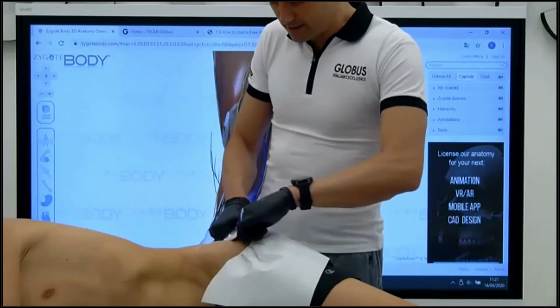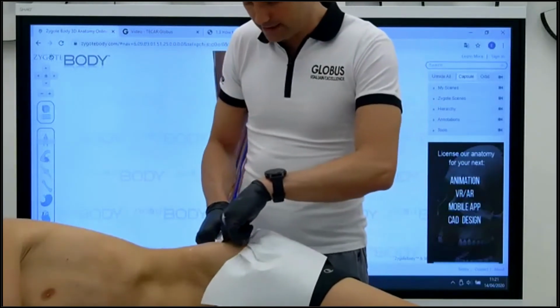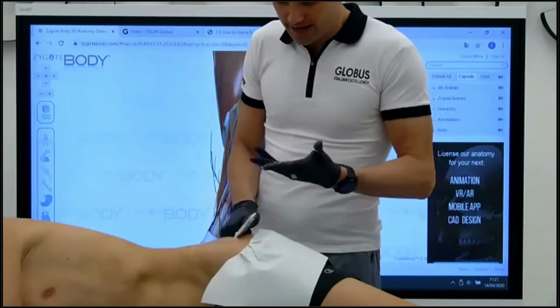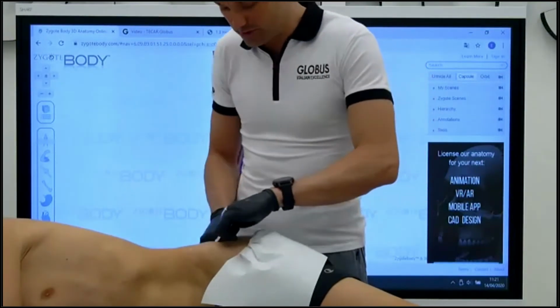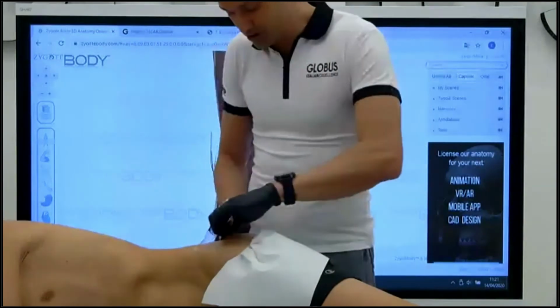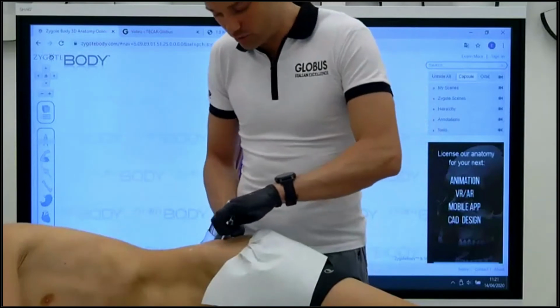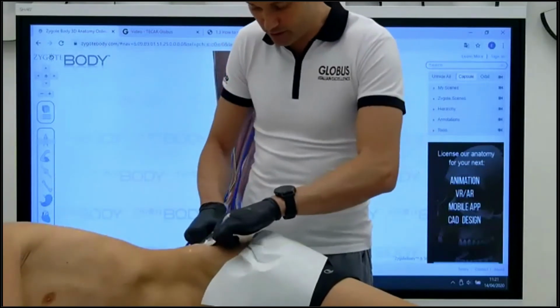As Diego said before, we need to perceive the tissues. The tissues tell us the right duration. It could be 3 minutes, it could be 10 minutes, it depends on the patient: if he is well hydrated, and whether we are talking about a chronic pathology or a fresh pathology.